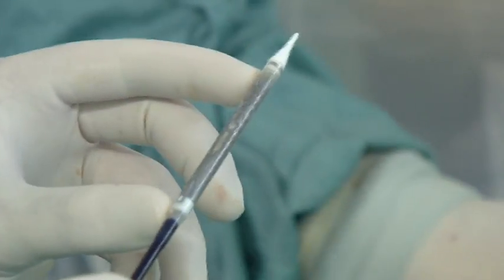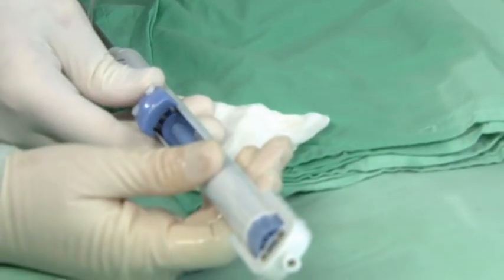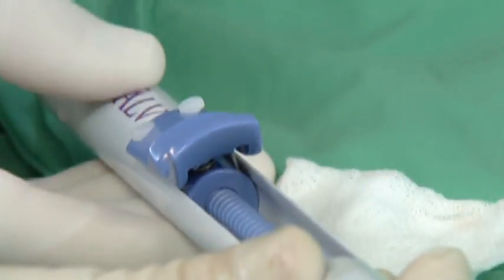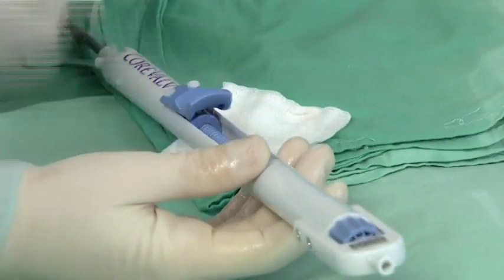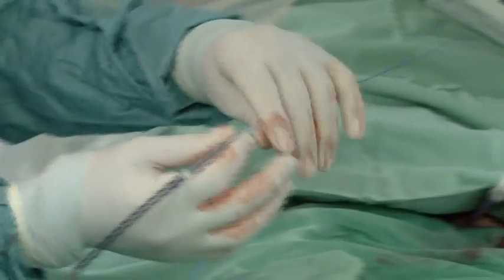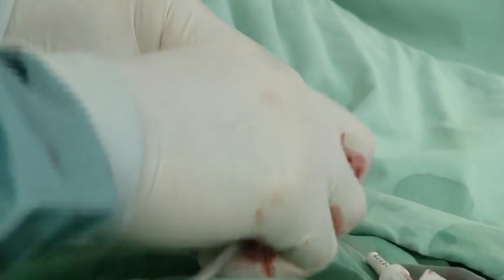And you see here the sleeve, you see the nose cone, and this is a handling device where we can unsheath and open the CoreValve in place, and we are going to demonstrate how we do that in a few minutes from now. But the first task would be to insert the CoreValve into the sheath and take it up into the aortic valve area. So Abed, maybe you can describe.